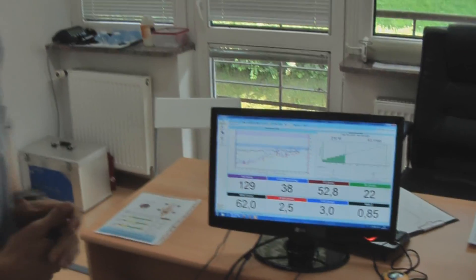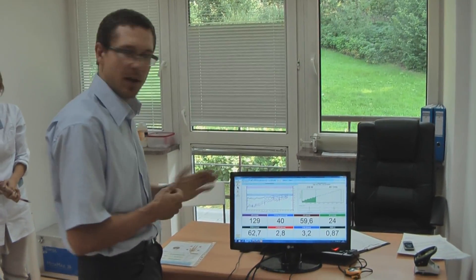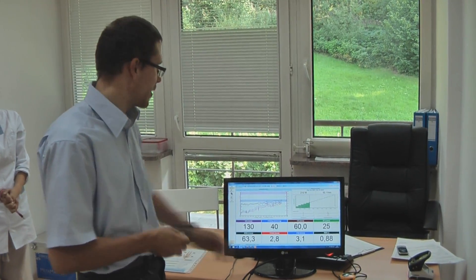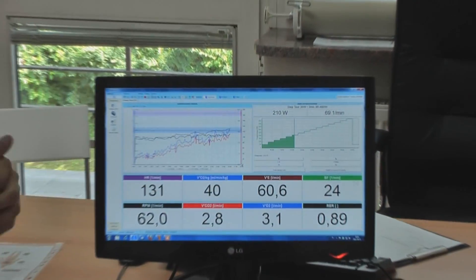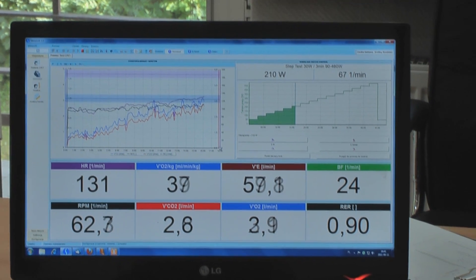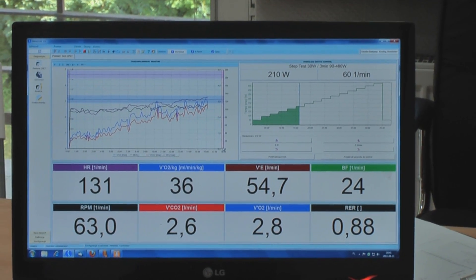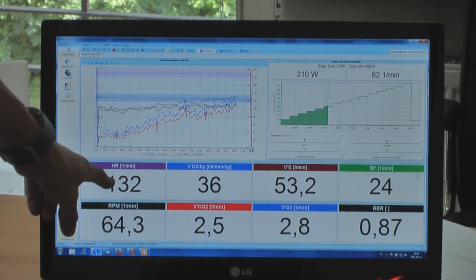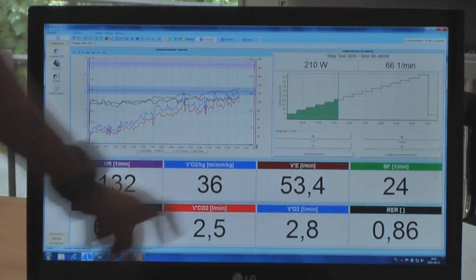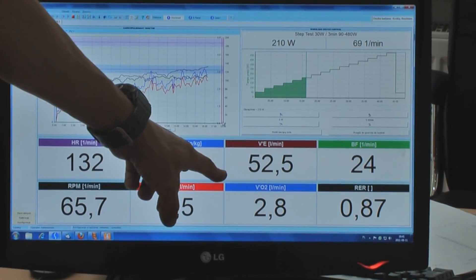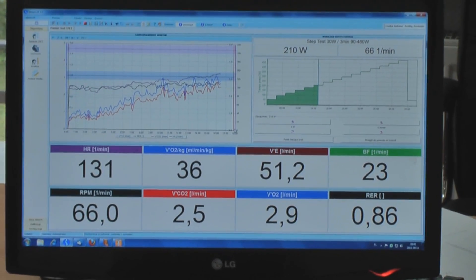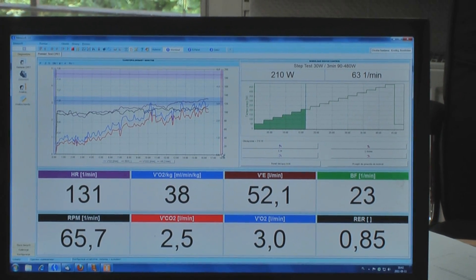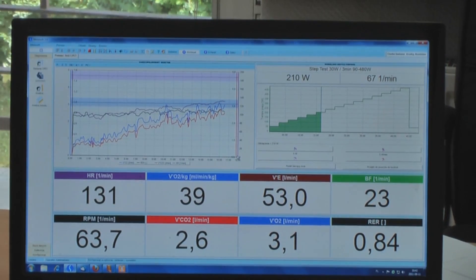On this monitor we see in real time the curves concerning the ergo's parameters. Here we may see the load — it's increasing. Now it's 210 watts according to the PowerTap. We see here the heart rate, the VO2 in liters per minute, and also the carbon dioxide.